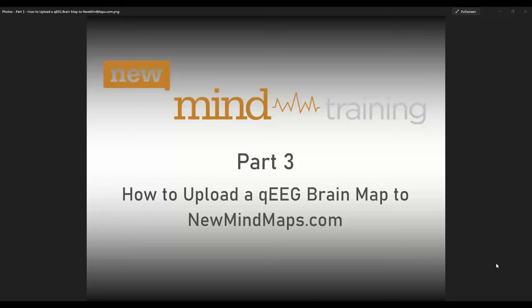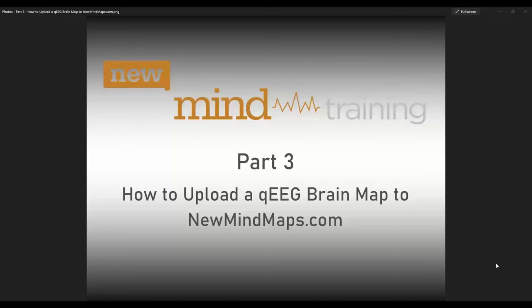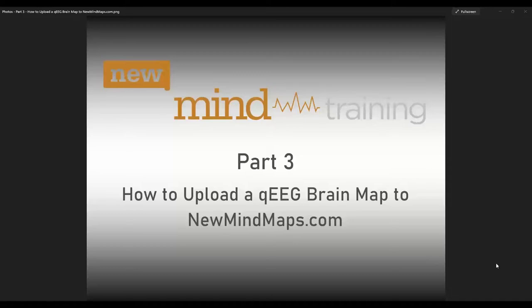Hello and welcome to part three of our training series. In this webinar, we are going to cover how to upload a QEEG brain map to newmindmaps.com. I will be showing everybody this two different ways. First, we're going to go through and talk about how to upload a map through the newmind clinical software. This would be if you have the pro subscription. And then we will follow that up by showing everybody how to upload directly through newmindmaps.com, which would be if you have a basic subscription.